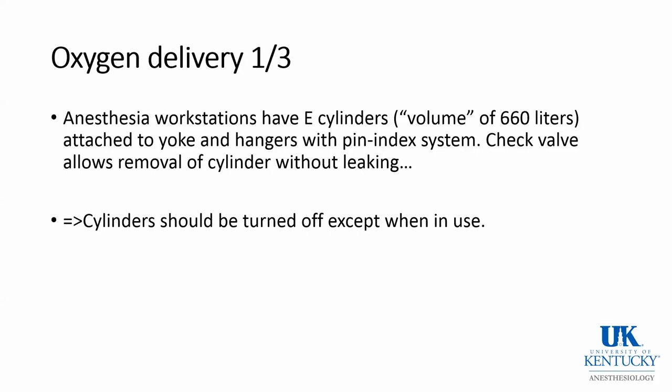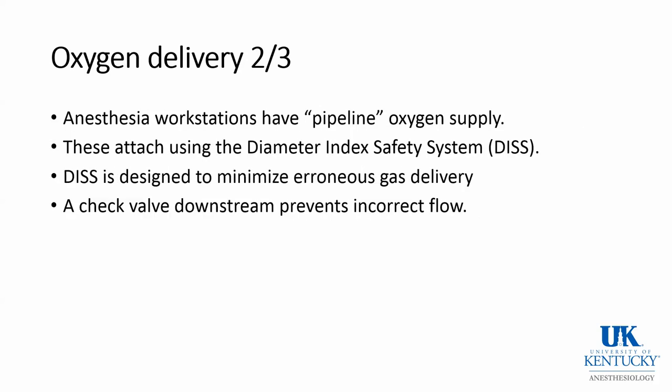The cylinder should be turned off except when in use. Anesthesia workstations also have a pipeline oxygen supply. These attach using the diameter index safety system. And this is also designed to minimize erroneous gas delivery. There's a check valve downstream to prevent incorrect flow.